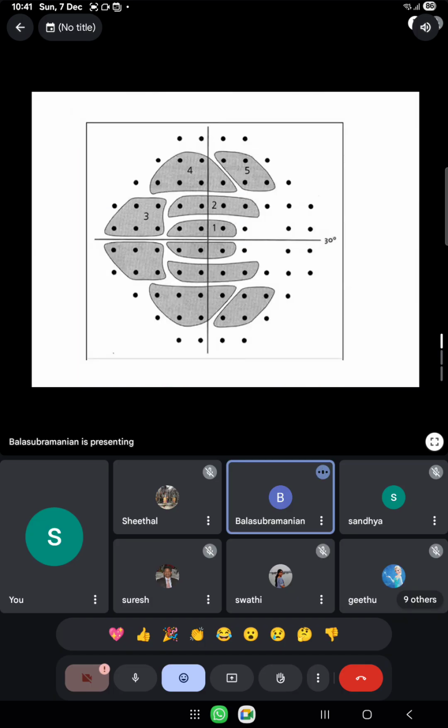What is this? This picture has a meaning. What is this? Glaucoma hemifield test. It has a meaning. It is trying to imply something. It compares 5 zones. Right and left? 5 zones, superior and inferior, upper field and lower field, which are mirror image zones.